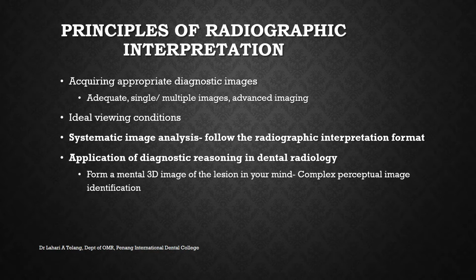Lastly, application of diagnostic reasoning in dental radiology is something which is acquired, and the skill can be acquired by viewing more and more radiographs and correlating it to the clinical findings, and looking through the images again and again to understand what is normal versus what is abnormal. What happens is we tend to form a mental 3D image of the lesion in our mind, and this complex perceptual image identification is what gets retained in the brain, and each time you look at it, the eyes send the signals to the brain and you identify it as normal versus abnormal.